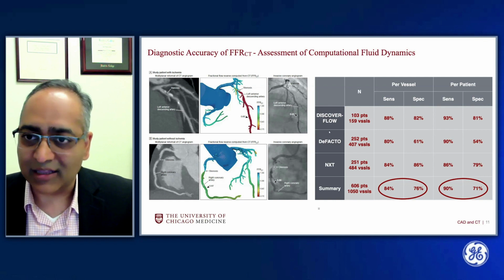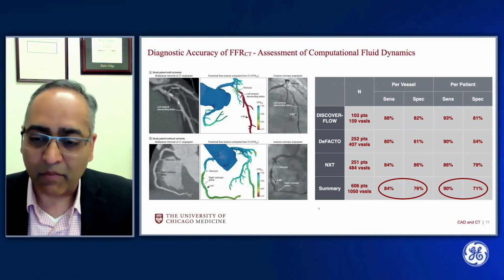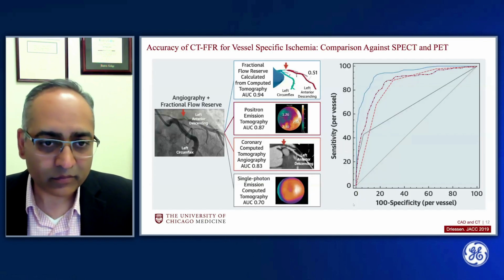Multiple studies have looked at the diagnostic performance of CT-FFR and have shown that on both a per-vessel and per-patient basis, the diagnostic performance of CT-FFR is excellent.